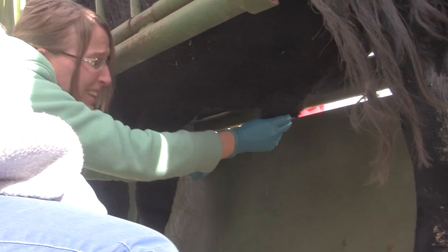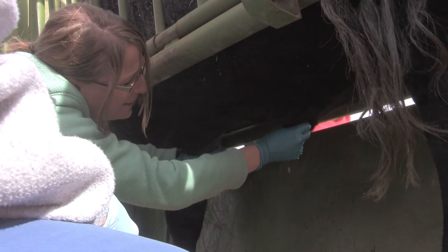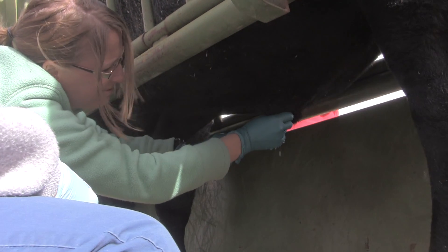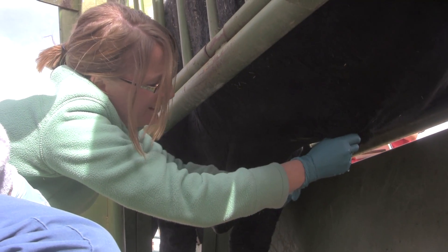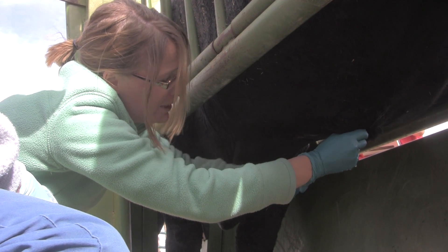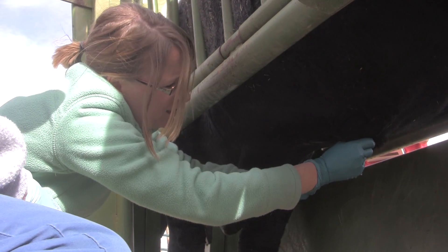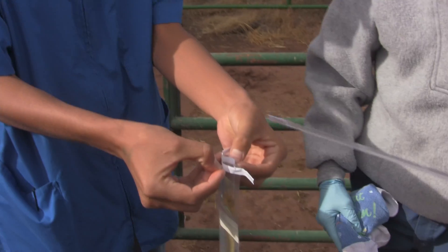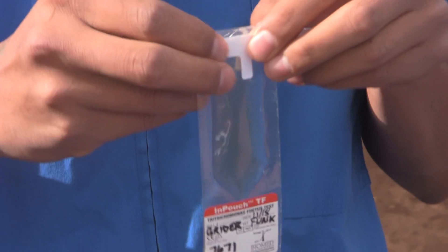You're going to have to work it — you don't want to get too aggressive, but aggressive enough so you can get a sample. I'm drawing it right into the syringe there. Get that down here. That's it.